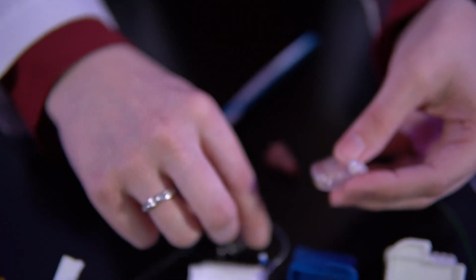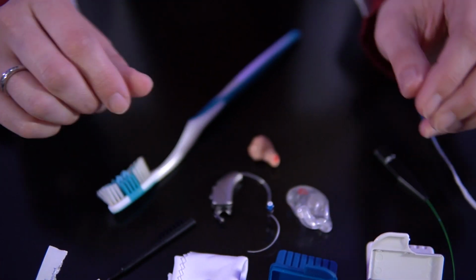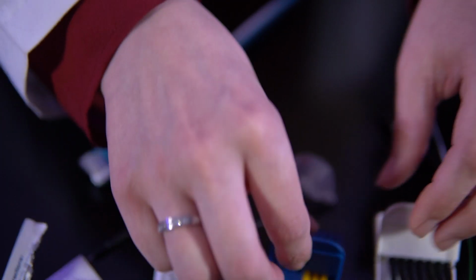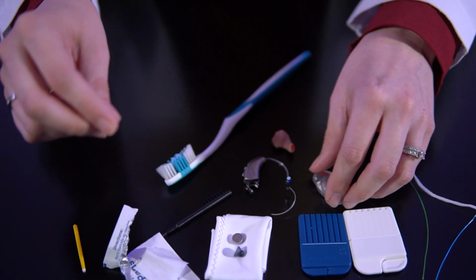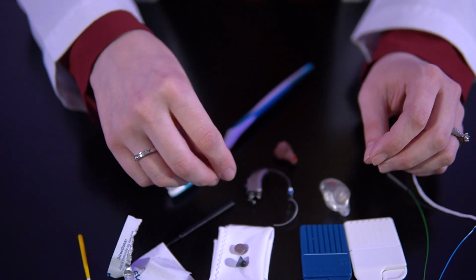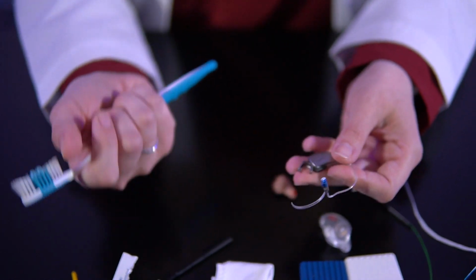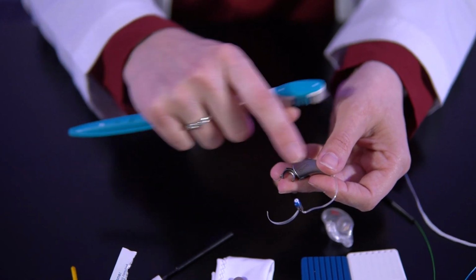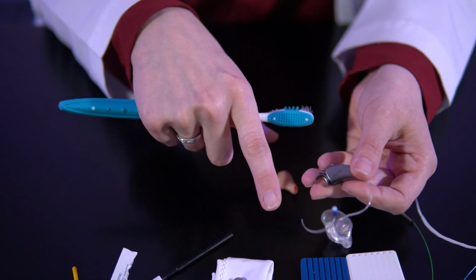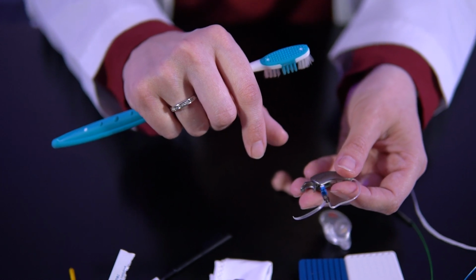Now, some people ask, how often do I have to change my wax filters? And I always say, well, that's gonna depend on how much wax you have in your ears. Some people can go months without having to change it. Other people, like Dr. Young, don't even wear them because he produces way too much wax. And some people can go about a week. If you don't know how much wax you have, just get in a good habit of cleaning your hearing aids once a week. Again, keep up on that maintenance, and change your wax filters at that same time, okay?